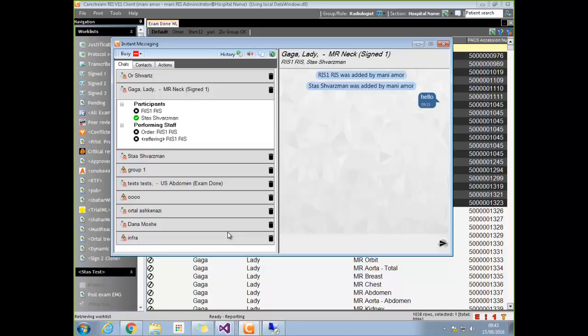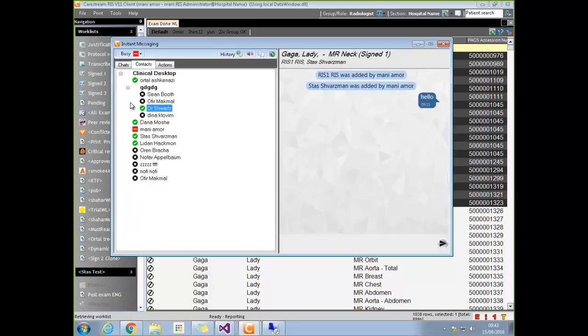What about the UI in general, having a contacts list? Is it useful having a contacts list, or would it be better to have a small search box? Would you have a favorite list of users, or would it be easier to just work with groups inside RIS, or? I use it in Notes, but I'm not a radiologist.